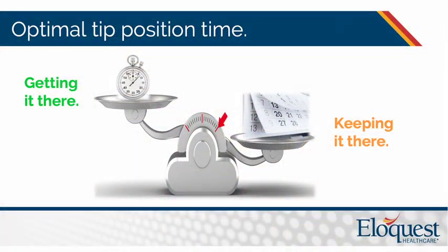Okay, so let's think about the time. How much time does it take you to get the right catheter expertly placed by you in the right place? Even if you include all the assessment you did beforehand and the charting after. It can be measured with a stopwatch, all right? Now, how much time does that catheter need to remain in place? That has to be measured with a calendar. But yet we put a ton of time and money into getting it to the right place, and securement is an afterthought.